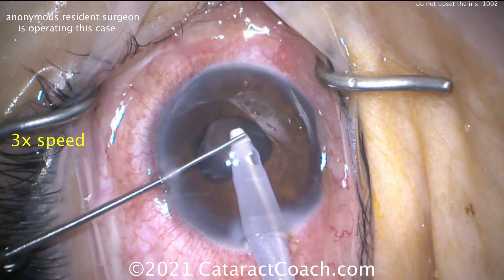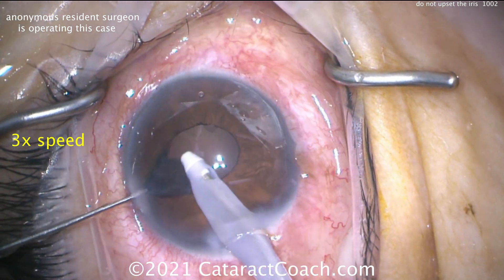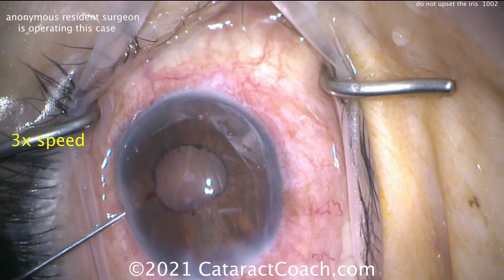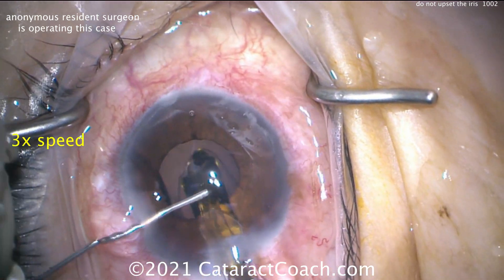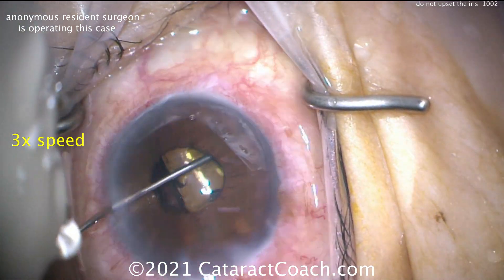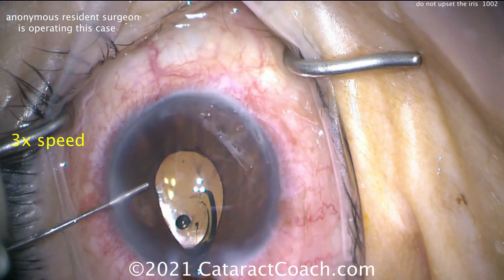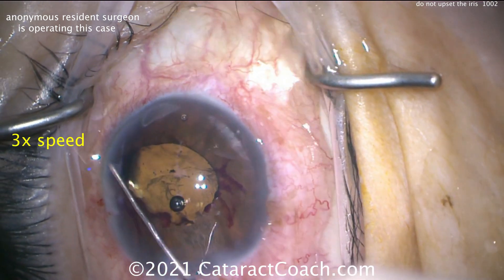Here comes the coaxial I/A, and using the second instrument in the left hand — it looks like an iris push-pull — in order to expose the lens cortex that is in the capsular bag and fully aspirate it. That looks pretty good. Now we'll inflate the capsular bag, really expand it open, make sure there's no lens material left inside. Here comes the lens — nice and easy, deliver that inside the bag, and that looks pretty good. That's a six millimeter optic on that IOL. The pupil's probably about three millimeters here — it's okay, it works out fine. We learned an important lesson in this case.